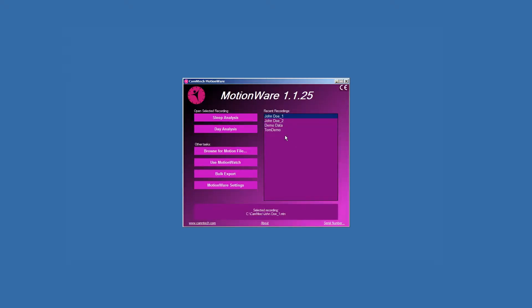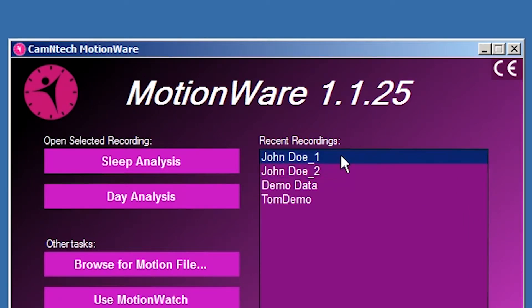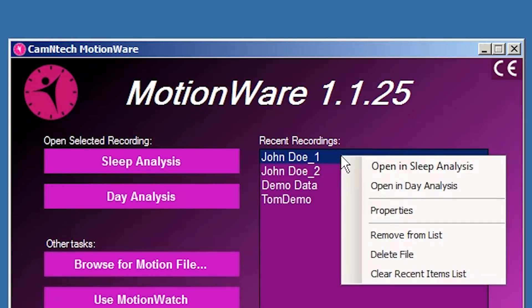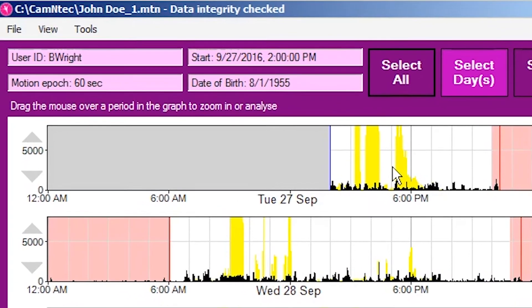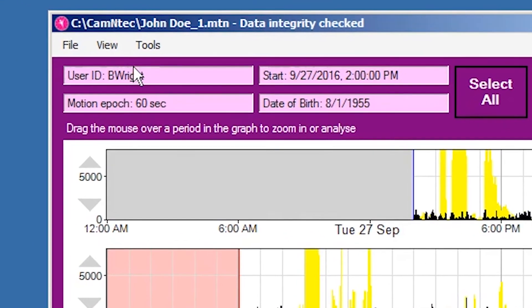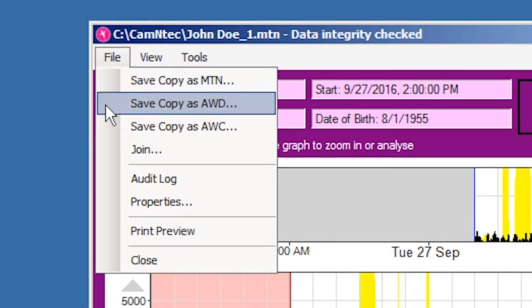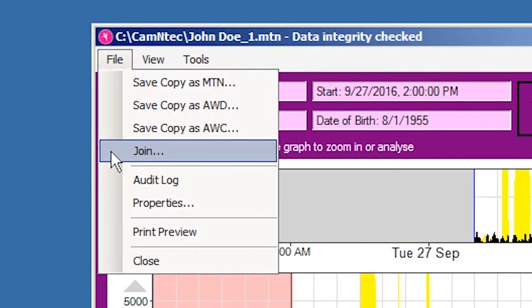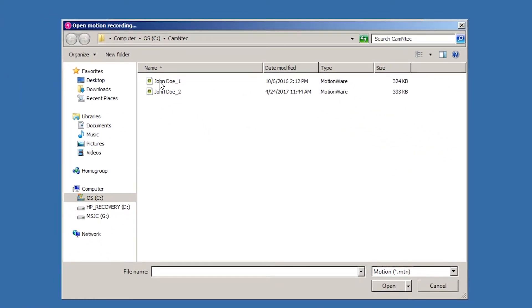For example, for a continuous recording for John Doe over several weeks, we would recommend doing the first recording named John Doe 1, then after week 1 start a new recording, John Doe 2, etc. These files can then all be concatenated into one file using the Join feature. Generating a long continuous recording in this manner eliminates the offset from time gaps during data download.